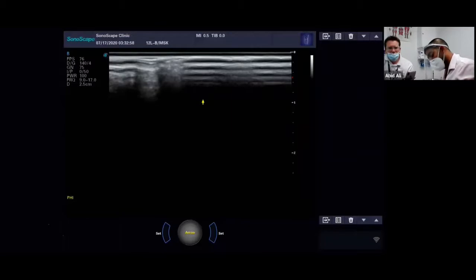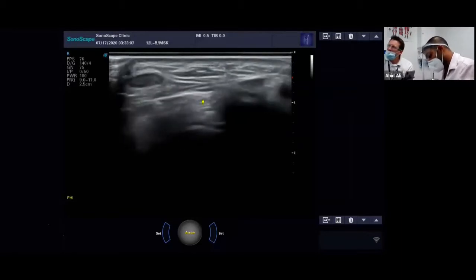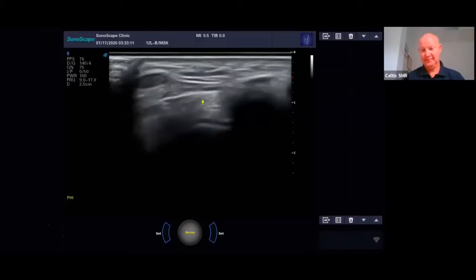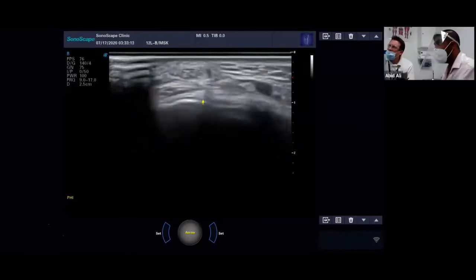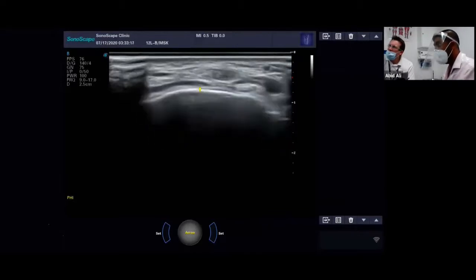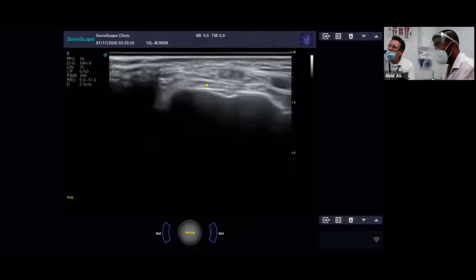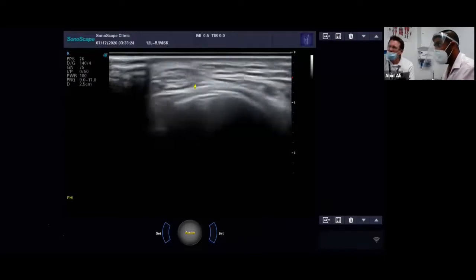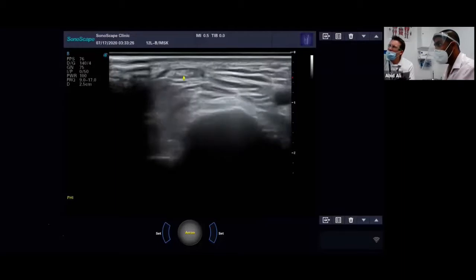Ask them to lift up the ankle, and you can just find the two ankle bones, the malleoli, and plonk your probe somewhere on the medial aspect between the two. And you're pretty much onto the tendon there. So you just bring it into the center of the screen, and you need to move medial or lateral. Always keep the structure you're looking at in the center of the image. Of the screen, sorry. So you can see it's quite oval.